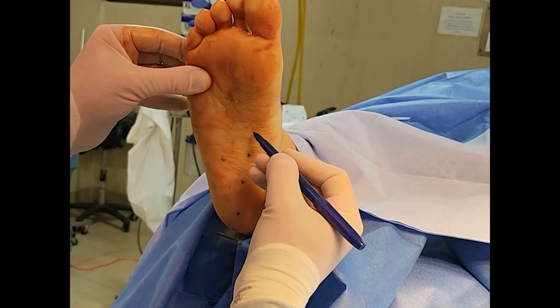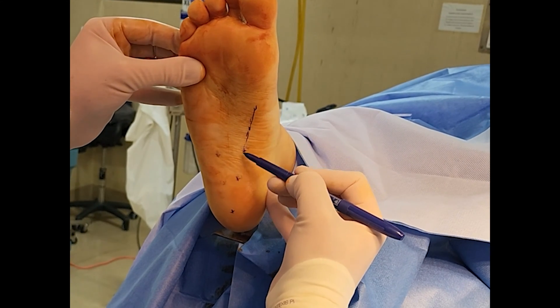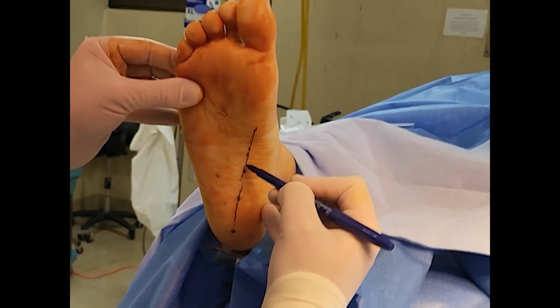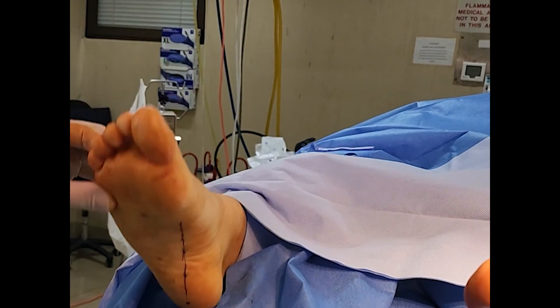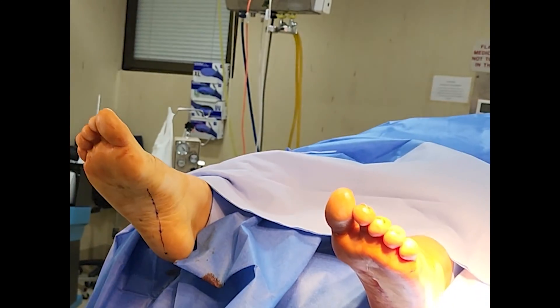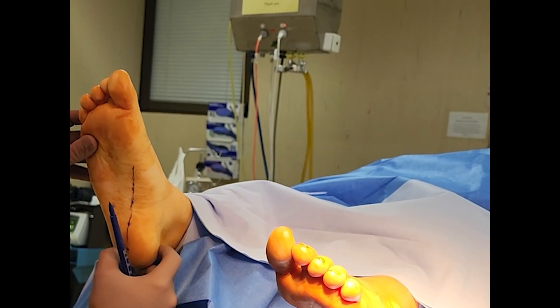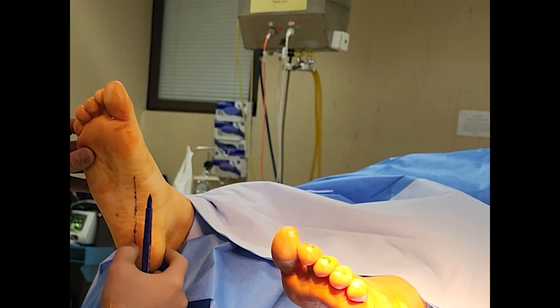From lateral to medial, pressure was applied with the thumb, starting from the heel and working upwards towards the mid-arch level. When inversion of the foot was noted, this is the spot where I marked on the foot. I've made a few other videos demonstrating the surgical technique of implanting the subtalar joint arthroresis, so I've skipped it in this video.